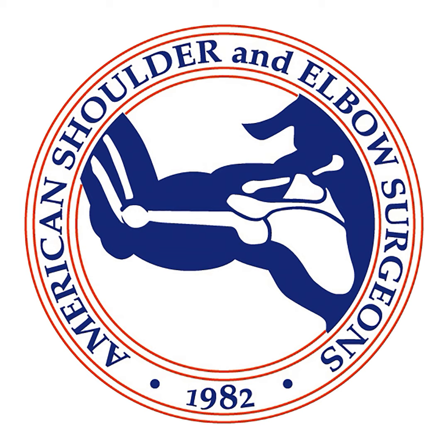One final advantage is that there's no reliance on the humeral canal, so you're really free to do a better job replicating that patient's normal anatomy. With a stemmed implant, that stem can only go in one place, down the canal. With a stemless implant, it doesn't really matter what the relationship between the metaphysis and the canal is. So I think it's a little bit easier to get the head position just right and replicate that patient's anatomy. And certainly in a malunion case, if you have a proximal humeral malunion or a malunion of the upper shaft, a stemless is a very nice way to go.